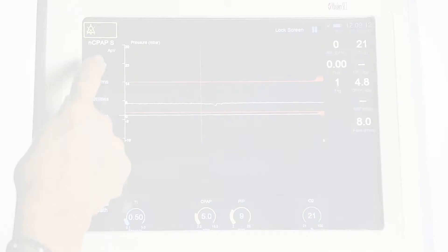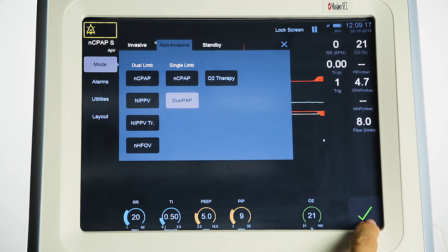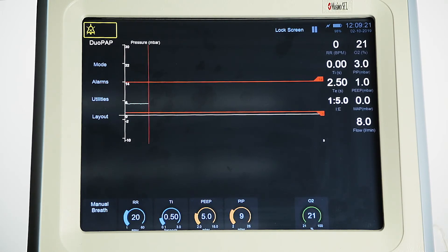DUO-PAP: Select mode, select DUO-PAP. Dual level, non-invasive positive pressure ventilation. In this mode, the ventilator generates a continuous positive airway pressure at a level set by the user.